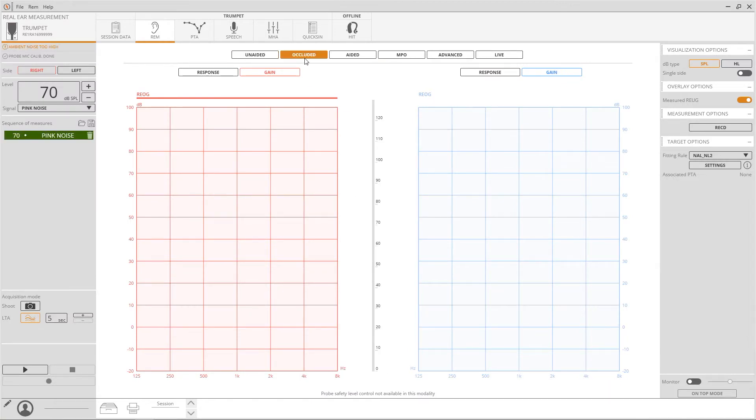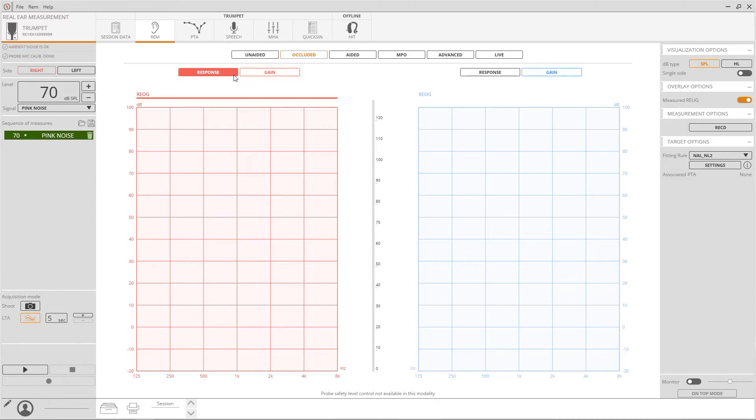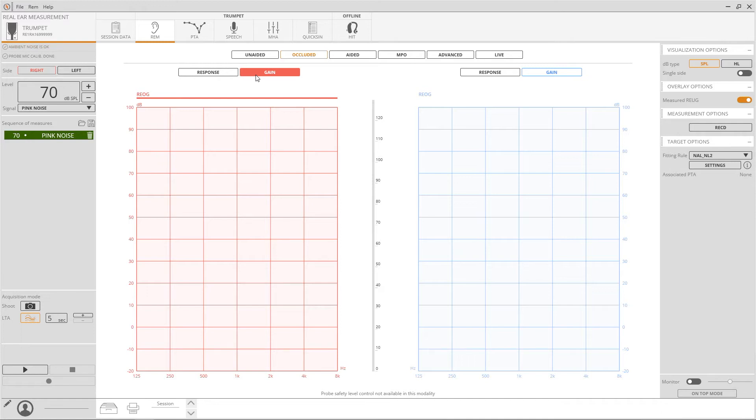Please note that the acquired measurements can be represented either as the signal caught by the probe microphone called response, or as a differential value between the probe and reference captured signal called gain. During this video series all examples will be displayed as gain.